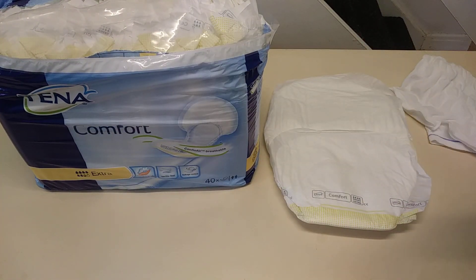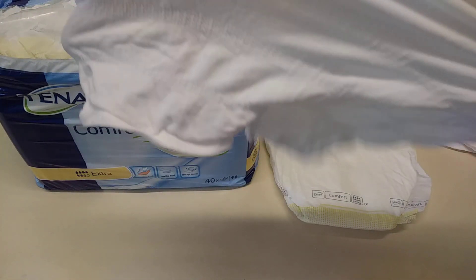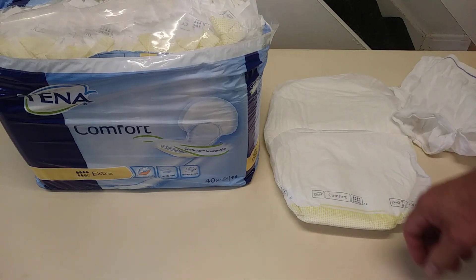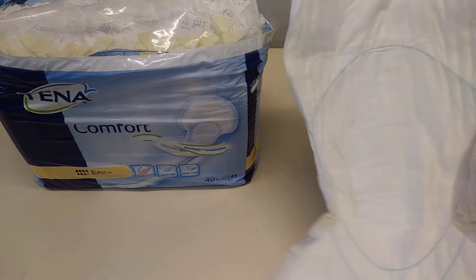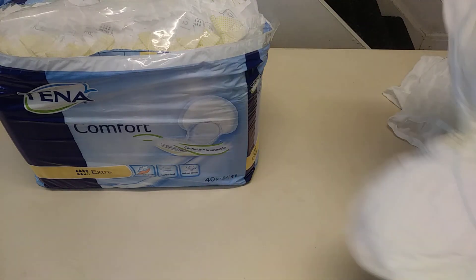You use it in conjunction with these — obviously I can't show you that because of YouTube, but you get the idea. This is a medium. Go for something that's going to be tight but not too tight, because if you've got this pad as well, you've got to bear that in mind.